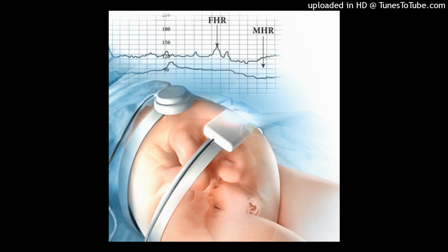Limitations of auscultation and palpation. The limitations of auscultation and palpation are as follows. Difficult to perform in some situations, such as hydramnios and maternal obesity. Patient may be intolerant of clinician's touch during contraction. Does not provide a permanent, documented visual record of the FHR or UA. Counting of FHR is intermittent.